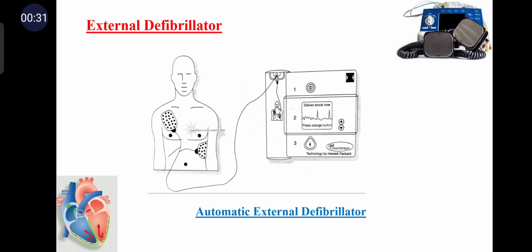In this external defibrillator, an important development in the field of defibrillation has been the development and successful use of smart automatic or advisory external defibrillators, which are capable of accurately analyzing the ECG of the patient and making reliable shock decisions. They are designed to detect ventricular fibrillation with a sensitivity and specificity comparable to that of well-trained paramedics, then deliver automatically or recommend the appropriate high energy defibrillating shock.